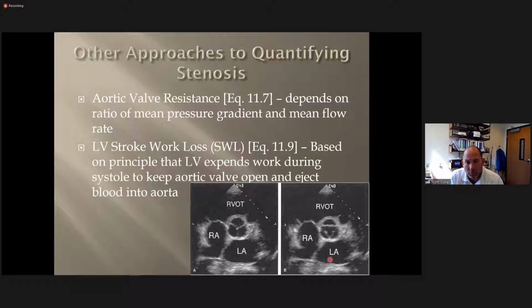Newer PACS systems have the ability to do it, and we have it here. I just choose not to, because I think it's good for students to go through and manually input it, since then you become more familiar with the process. But new systems will automatically transport the numbers from your calculation package into the report pages and put them where they belong. Then the doctors evaluate those numbers. But it's good as a student to go through that process manually so that you know what to change and what's going on. It triggers in your mind, like, oh yeah, I didn't notice that number was higher than it should be, or lower.